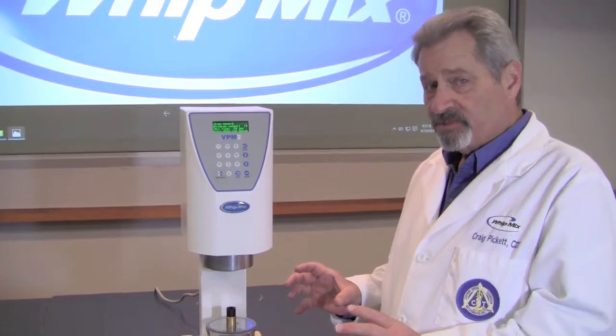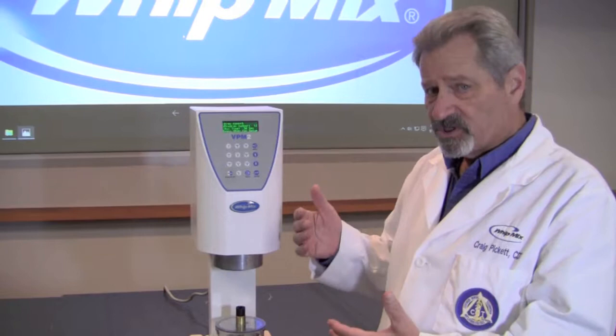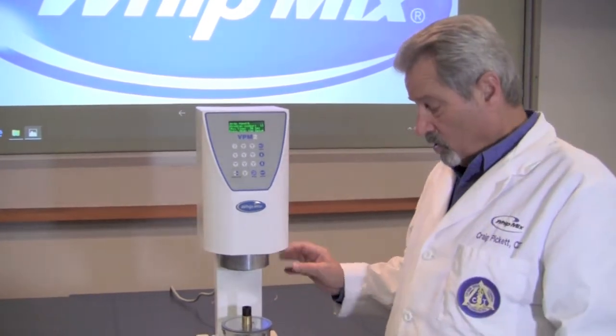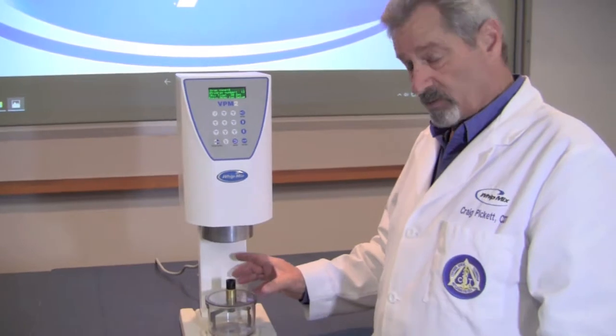Sometimes you may experience a vacuum error where you don't have vacuum going on in the machine, and we need to determine at that point whether it's the actual machine that's having a problem with vacuum, or it's the seals, or it's the bowl that's having a problem with vacuum.